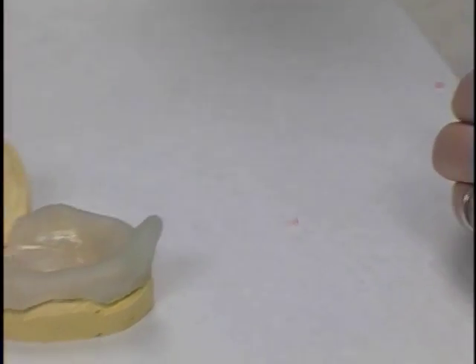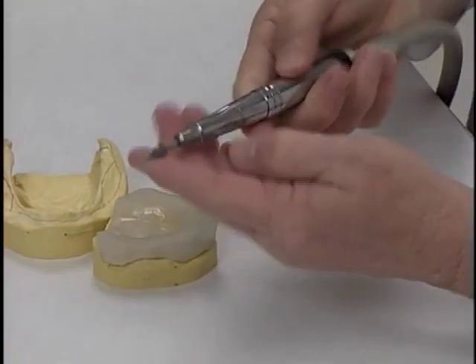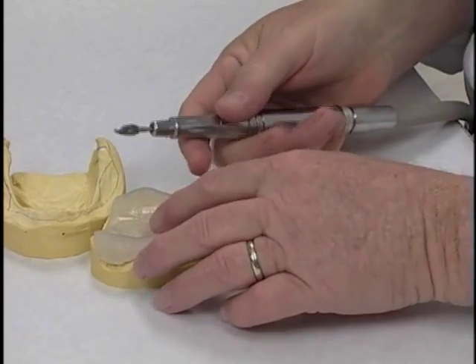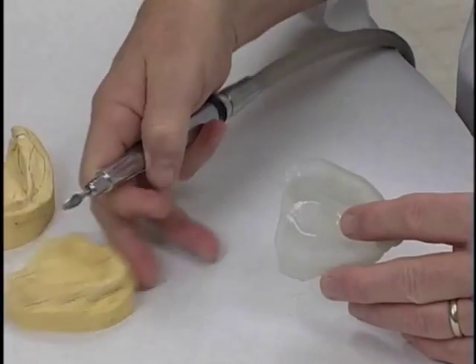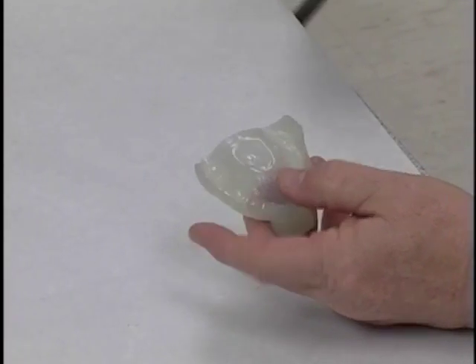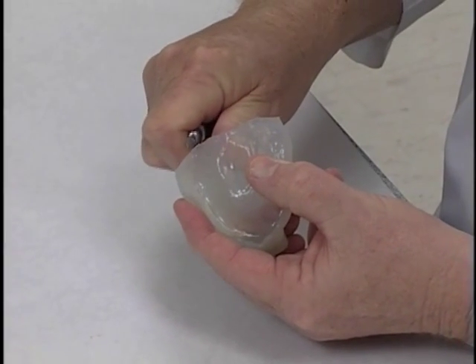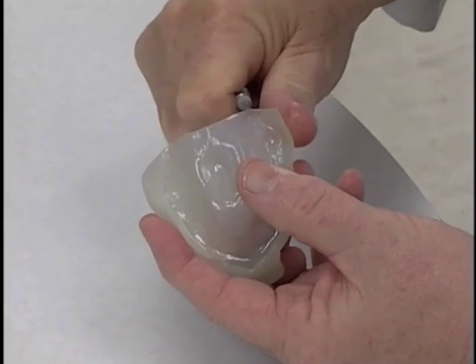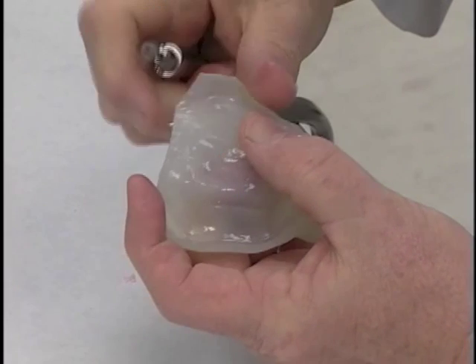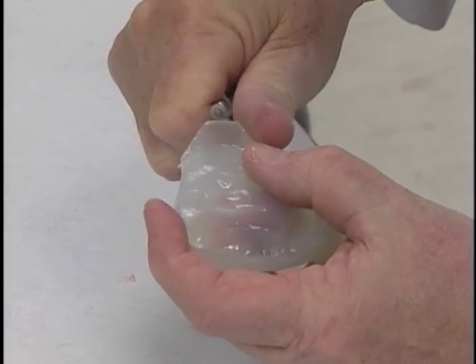So we use a fairly large burr in a slow speed handpiece to trim those peripheries. This will make a bit of a mess when you do this. And all we're going to do is just use these burrs and trim the peripheries till they're nice and smooth, not jagged or rough.